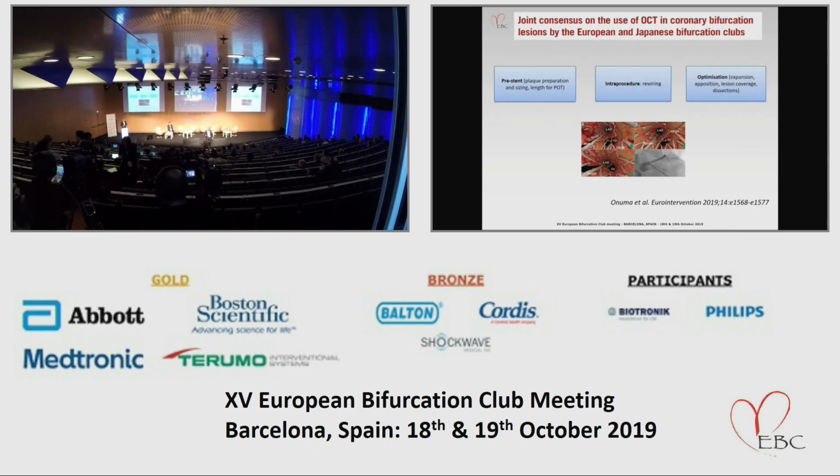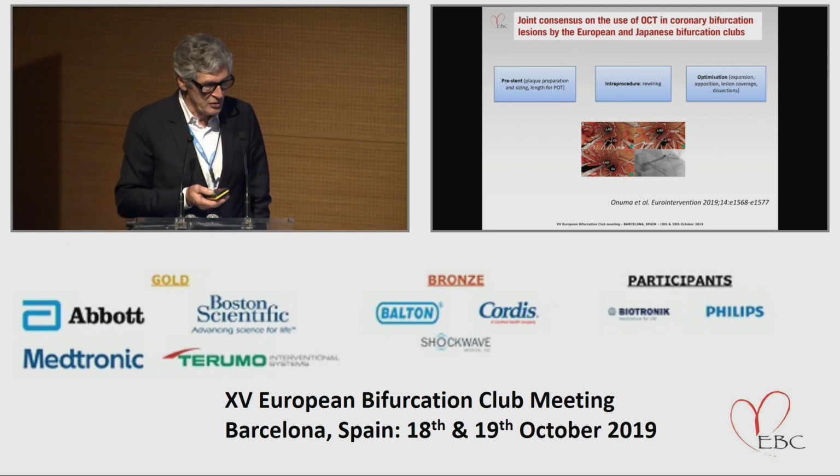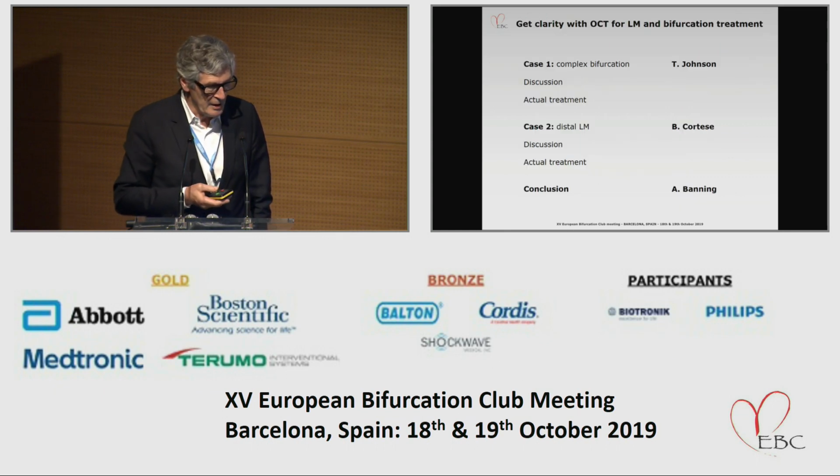This is a summary of the Onuma paper, the joint consensus on the use of OCT in coronary bifurcation lesions that you can read in EuroIntervention. I think this paper is really a must in this field, and we can learn a lot about the use of OCT in treatment of bifurcation lesions, left main, and so on.